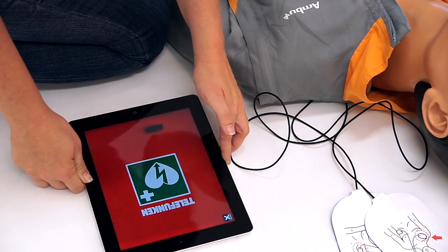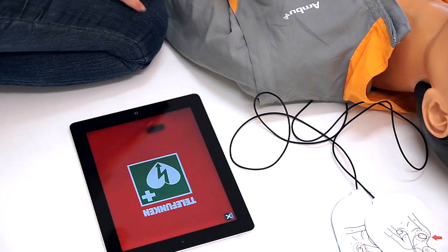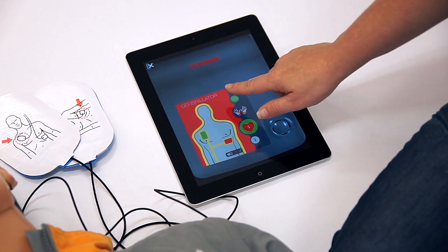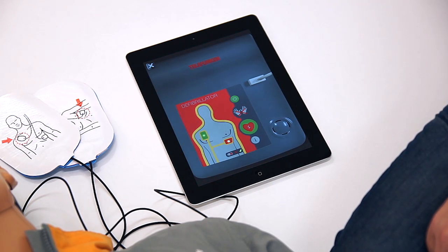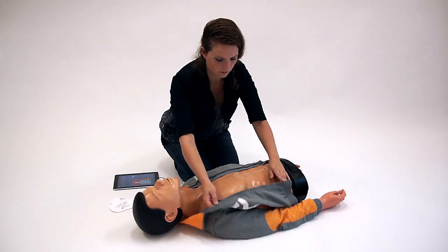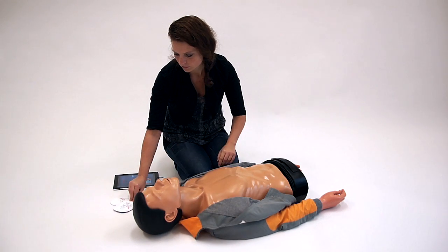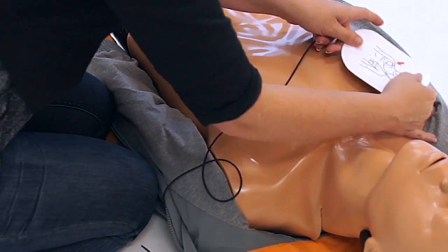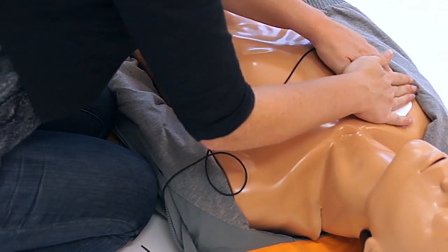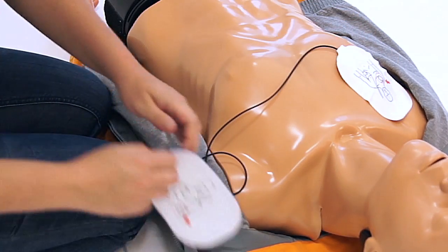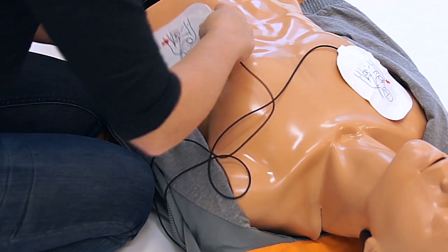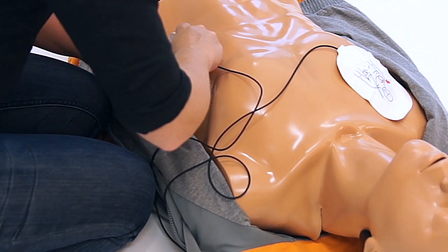With exactly the same trained properties as the real Trainer AED, it can be operated by your students or used for getting familiar with the different AEDs. All Trainer electrodes are suitable for use with the Tablet AED Trainer. Because it's for training purposes, physical connection with the electrodes to the Tablet AED Trainer is not necessary.